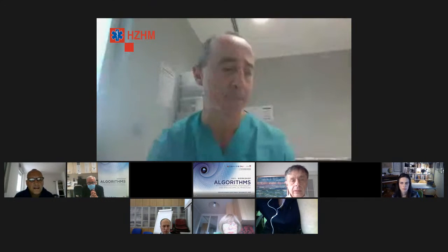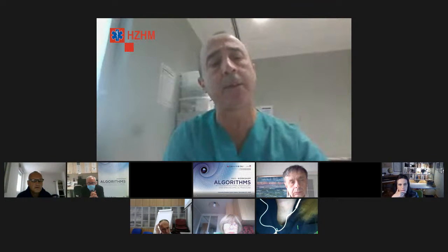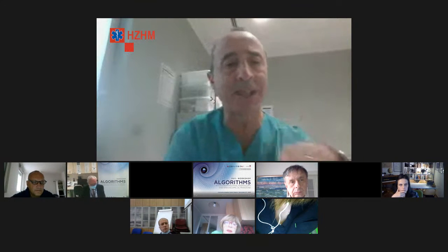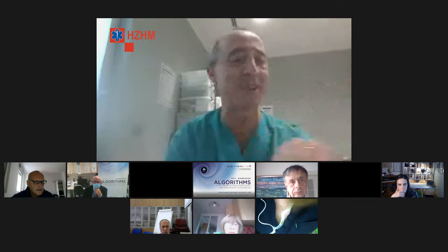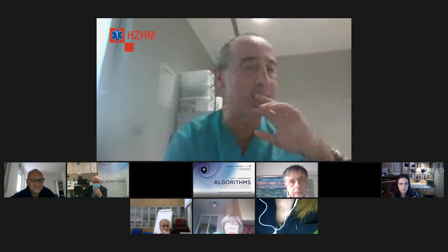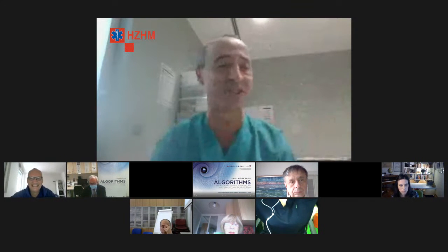So you perform POEM on an outpatient basis? We do POEM in the afternoon of Monday. We do 3 cases every week, and we discharge the patients on Tuesday morning, the day after, because according to the Italian rules, we don't get reimbursed if we don't do it in the operating room. So we cannot do it in the endoscopy space. The surgeons don't give us the operating room on all days, only on Monday afternoon. We are just neglected, so we can use only that space.